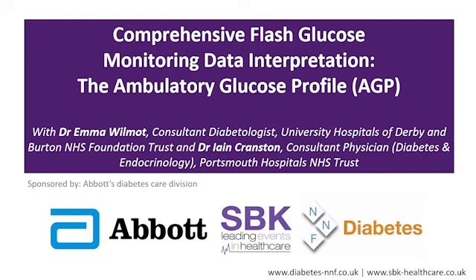Or what's the one thing I will do differently for the next sensor? It may be to do with a particular meal. It's almost trying to push that Kaizen principle across to the individual as well as to the consultation, because I just think absolutely that small steps in the right direction has to be the right approach for almost everybody around insulin self-management.